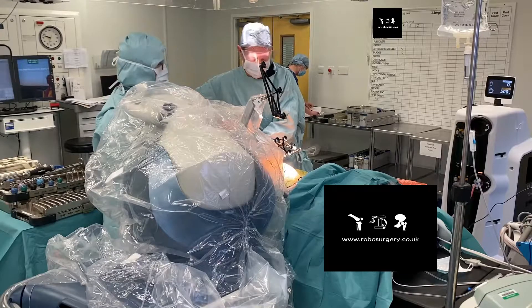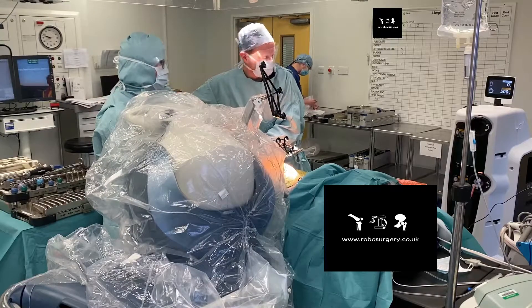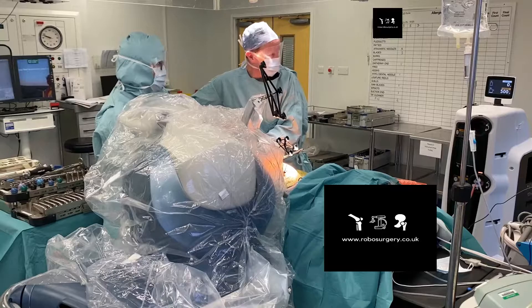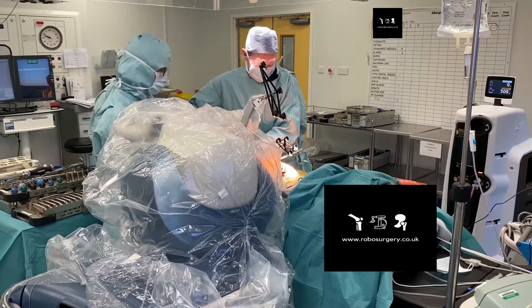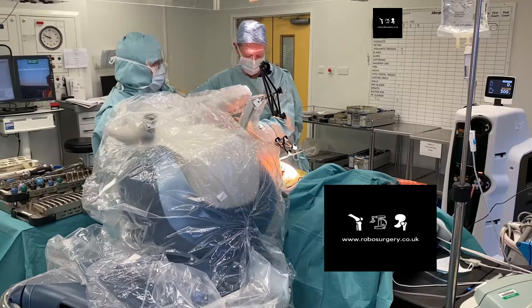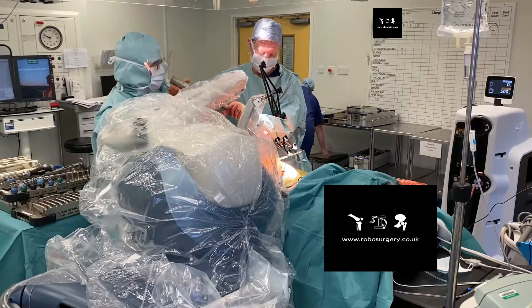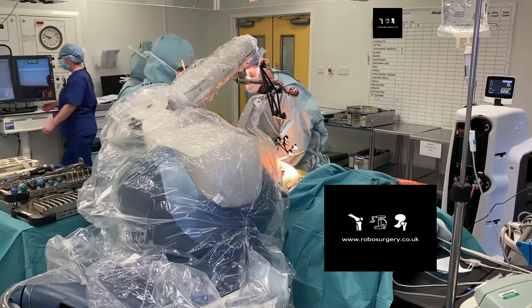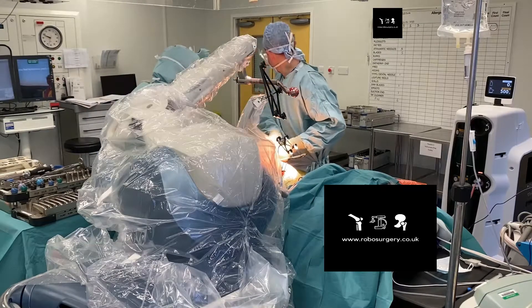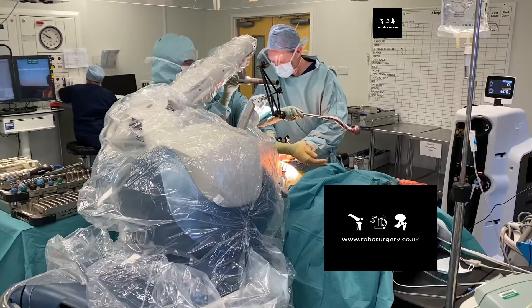If I'm out by 0.5 millimetres either anteriorly, superiorly, inferiorly, or posteriorly, the robotic arm will cut out and stop the reaming. If we deviate medially, again it will cut out and prevent any medial perforation. We can change the setting so if we feel we haven't reamed through the articular cartilage enough, we can add on another half or one millimetre and ream again. It's a really accurate system — it gives you confidence and cuts out the time of reaming. It also gives a more hemispherical shape by preventing multiple passes.